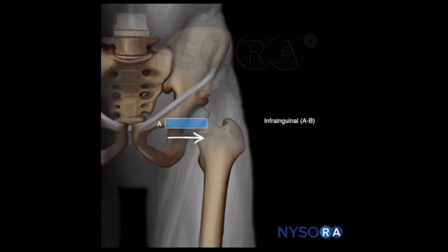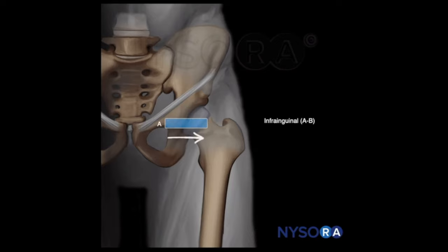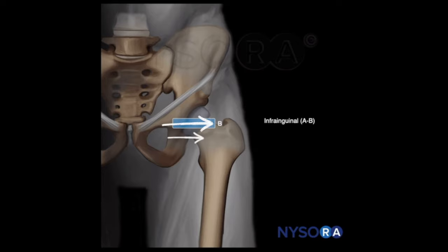Let's review the scanning principles for infrainguinal vs. suprainguinal fascia iliaca block. For the infrainguinal fascia iliaca block, we start scanning at the femoral crease. Once the femoral artery and nerve are identified, the transducer is moved towards point B, away from the femoral nerve, and the local anesthetic is injected underneath the fascia iliaca, lateral, away from the femoral nerve.